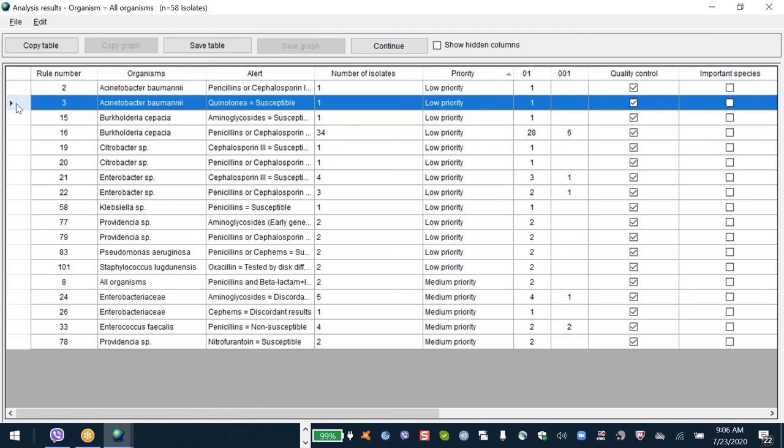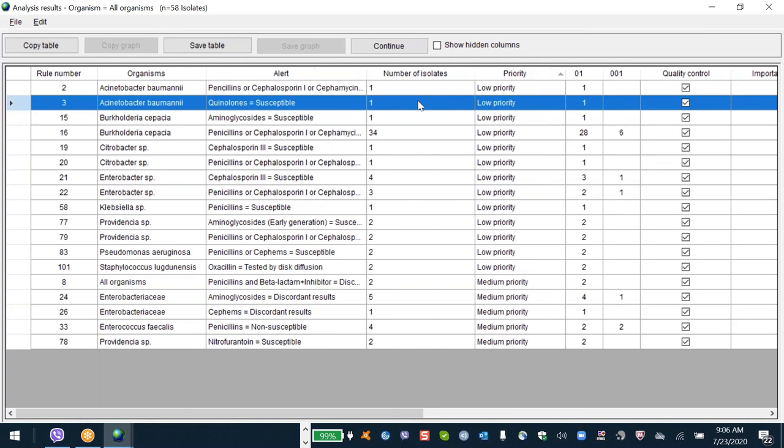You know, we have what are called minor errors and major errors and very major errors. An example of a major error is that the patient has a sensitive strain. Let's take the example of ciprofloxacin. A major error is the patient's strain is sensitive, but the laboratory said the strain was resistant. This is bad because the doctor could have used quinolones, but they didn't use the Cipro because you told the doctor it was resistant. That's a major error because there was a lost opportunity. You could have used Cipro, but you didn't. There's something even worse than a major error, which is a very major error.